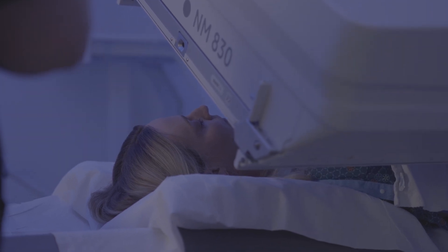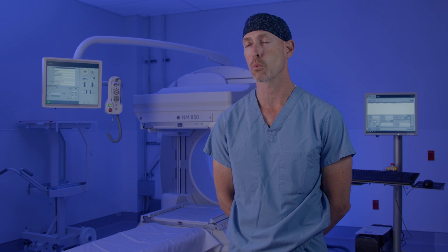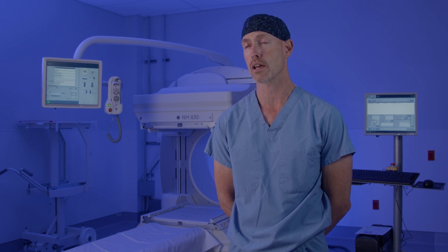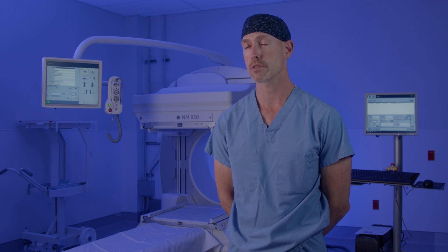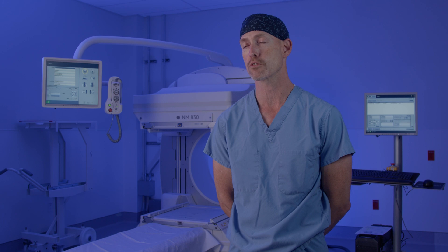It's fairly quick. Another important thing, and one thing that makes patients a little nervous sometimes, is that they're worried they're going to be inside a machine for this test, and that's not the case. You're not inside anything — it's not like an MRI. There's a camera that comes fairly close to the body, but you're not enclosed in anything. So patients who have claustrophobia usually do just fine with this scan.